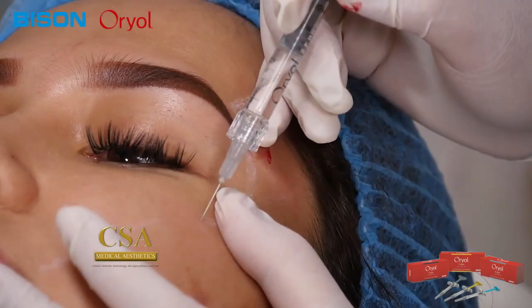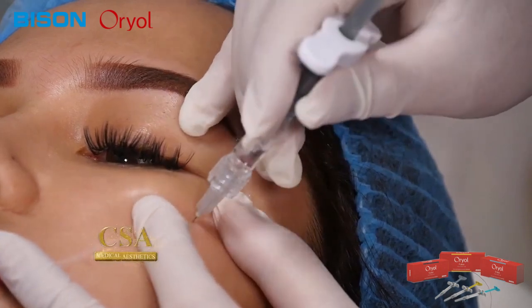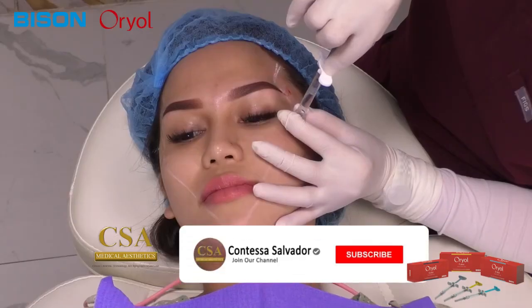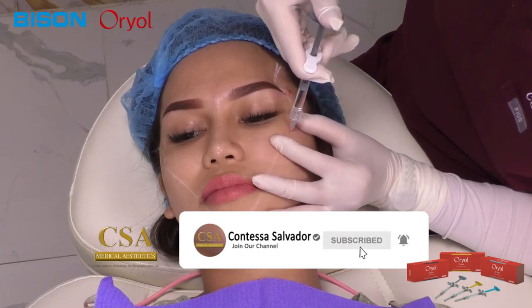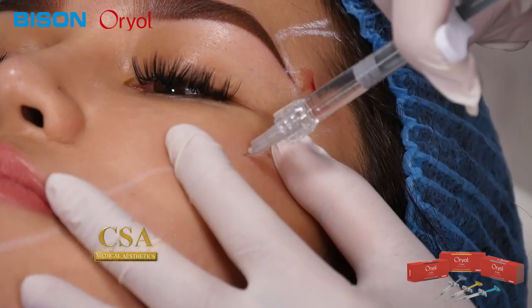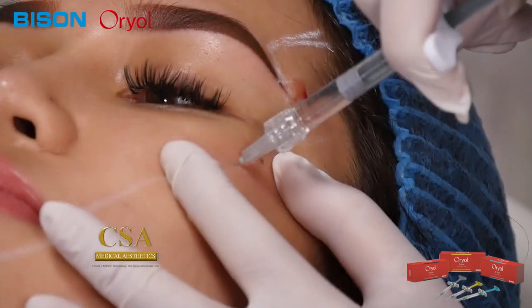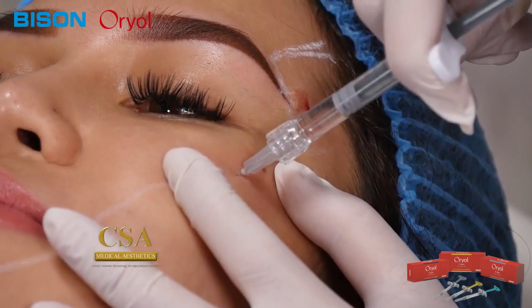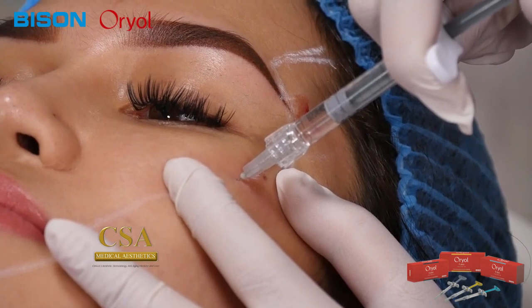So I already had the marking there, injecting onto the bone, okay? And then aspirating, wait a few seconds before you inject. I'll be needing around 0.2 to 0.3 in this region and pushing gradually. So it's normal to feel some gritty sensation there, and you can hear the push of the filler, right? Yeah, that's expected.